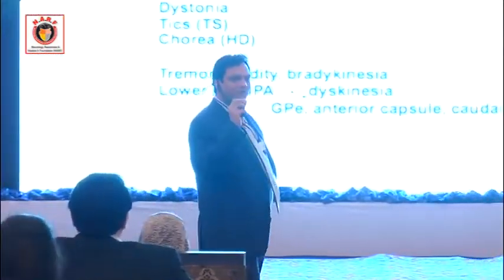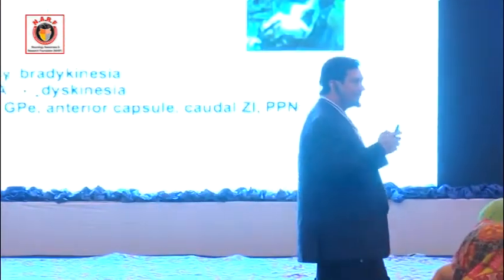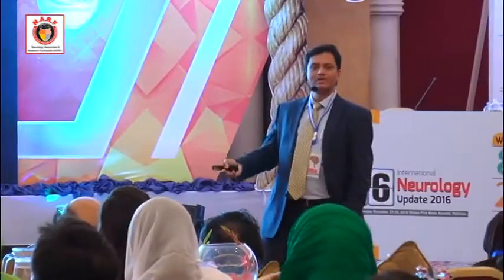And we'll do a very short, quick comparison of how they are different and how they are similar. Remember, principle number 3: motor symptom control is the same for both GPI and STN. There is no difference in motor symptoms. But then let's look at what is different.